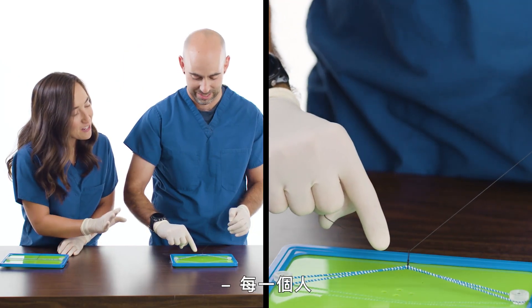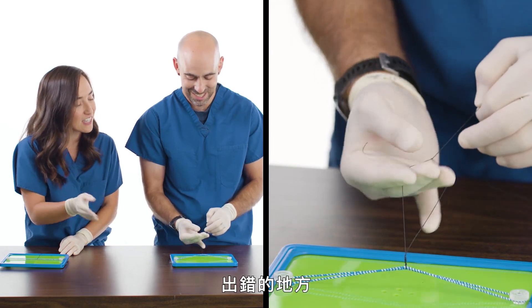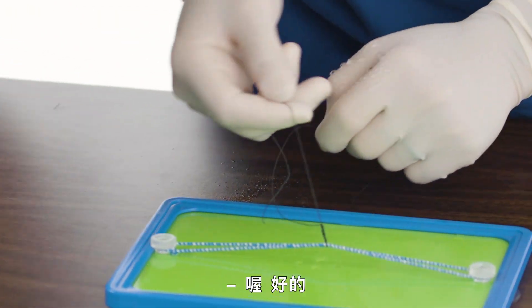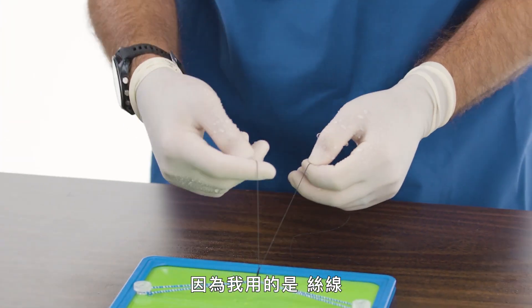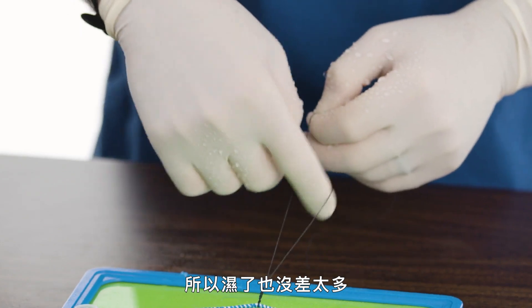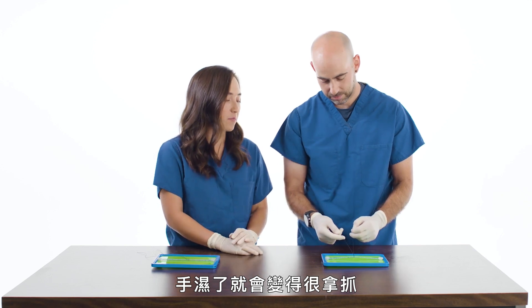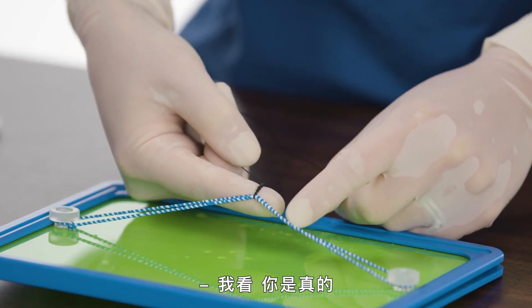Every different person makes their own unique mistake when they're learning how to do it. In real life, your hands are wet. Silk, because it's a braided suture, doesn't make too much of a difference. But if I give you a monofilament — a plastic one strand — that will be harder with your hands wet. But you're doing really good. You've really mastered the mechanics of the knot tying; you just need some polishing in terms of your tension and knot placement.